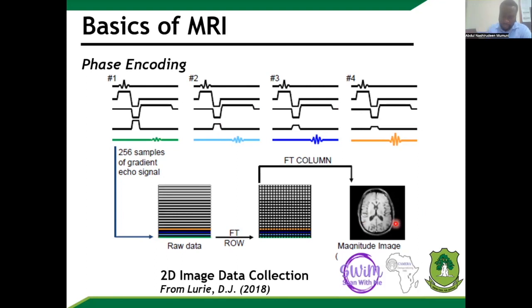So in the k-space information, the signals are in the time domain, and we'll do a Fourier transformation of the time domain raw signals into a frequency domain to create the image. And that's a mathematical procedure incorporated into the scanner software to do that.